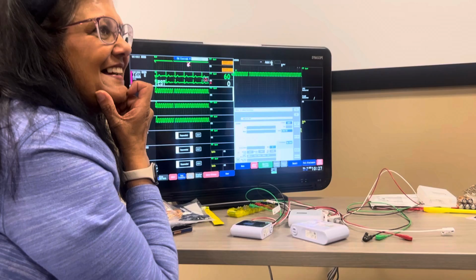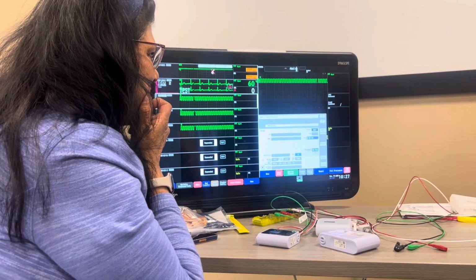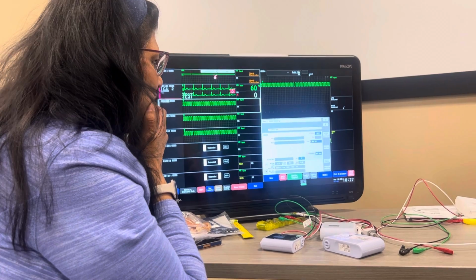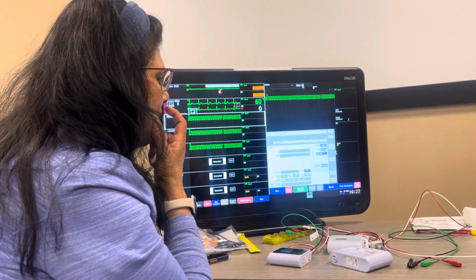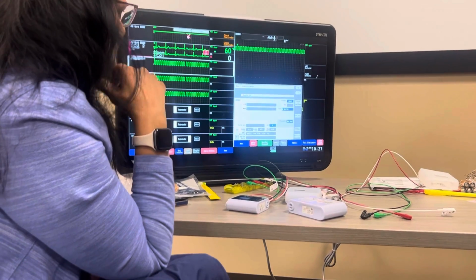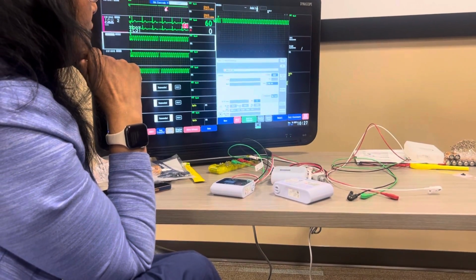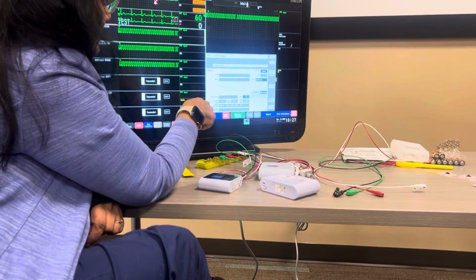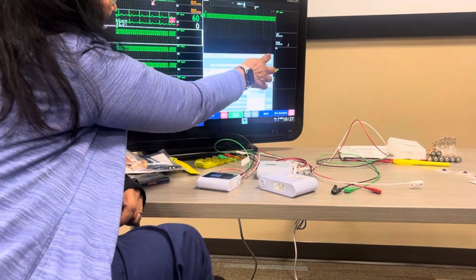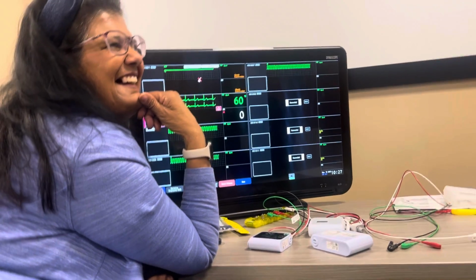Okay. In Admit Discharge? We're in that. Yep. And it tells you right there. Can we go down at all? No, that's your whole page. Age, birth date, height. Bed name register? Yes. That blank thing on the bottom? Oh, I was squinting. Bed name register. I didn't even read that. That's in there so you can pull the patient down so we can read the cage number right in front of it.